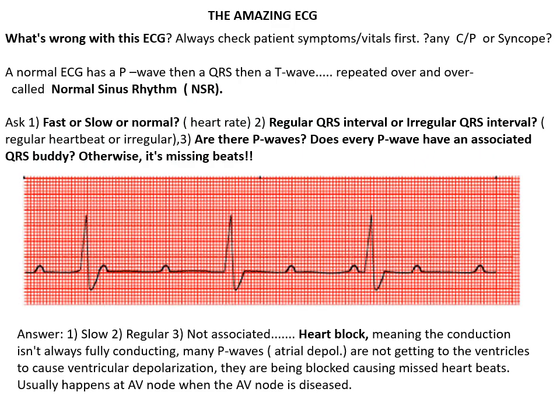Okay, so let's continue on and talk about the ECG. Before we talk about what's in this image, which is just a rhythm strip, this is just one strip. And remember, in an ECG, we actually get 12 different views of the heart. I'll show you an ECG on the next slide. But before looking at the ECG, we always want to know, what are the patient's symptoms? What are the vital signs of this patient? Do they have chest pain? Are they collapsing? Those are very important, even prior to looking at the ECG, okay? Knowing what's happening with the patient.